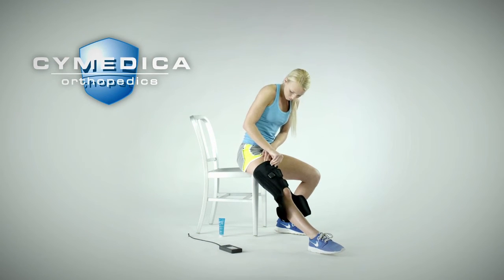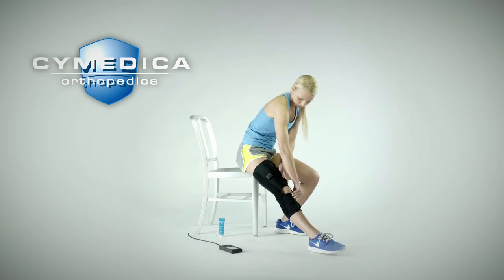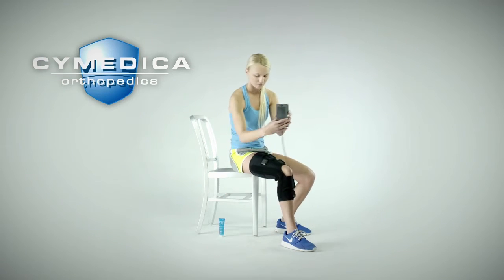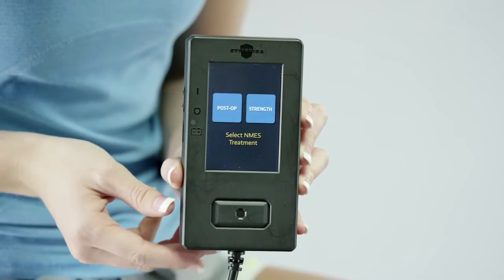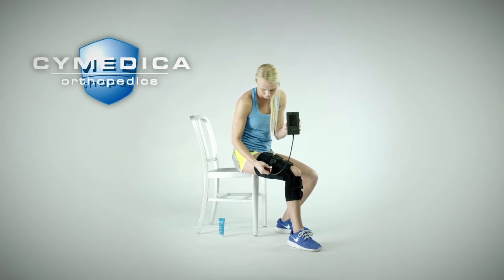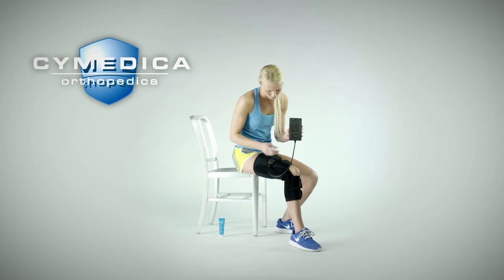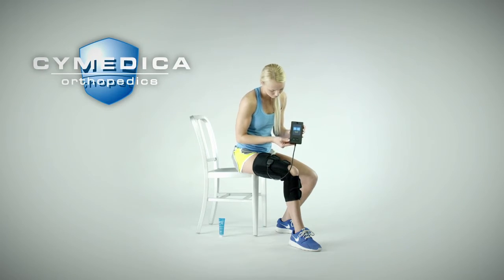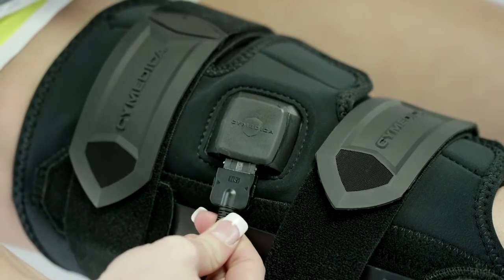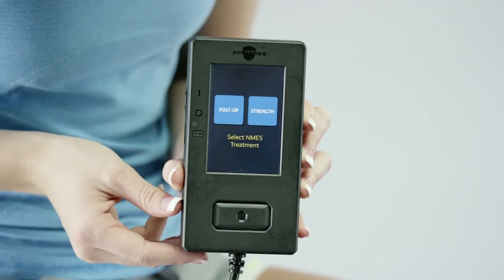While closing and tightening the conductive garment, verify the appropriate position of the electrodes and secure the strap ends to apply good compression to the knee and calf areas. Turn the power on to the user interface by sliding the on-off switch to the on position. The information button may be pressed to display the user interface hardware and software versions. The user interface screen will notify you to connect the user interface to an accessory. Attach the user interface cable to the conductive garment socket by aligning the logo on the connector and the logo on the garment socket. The user interface will display the available NMES treatments: post-op and strength.